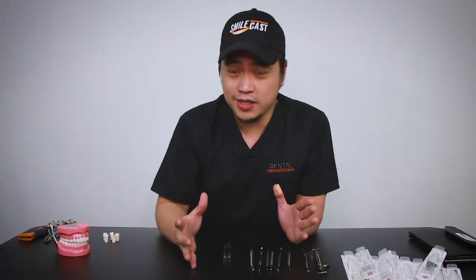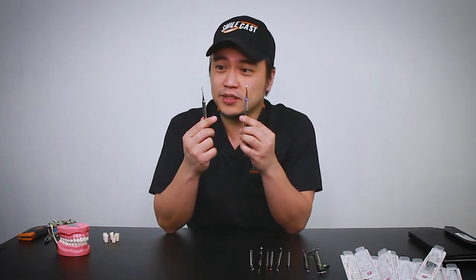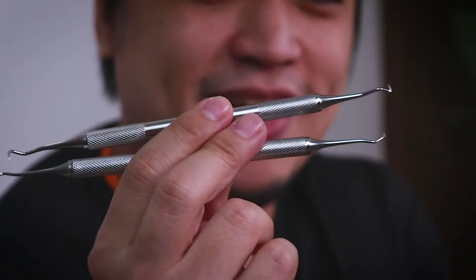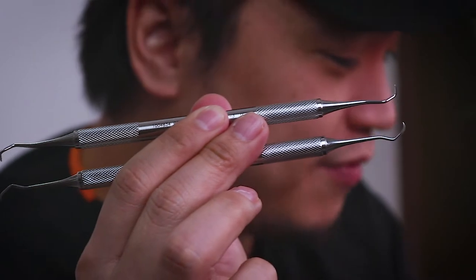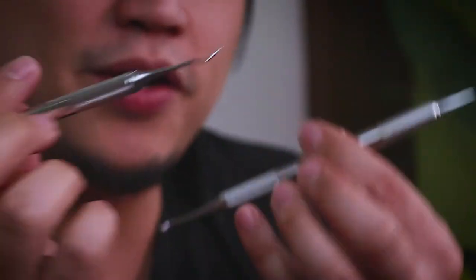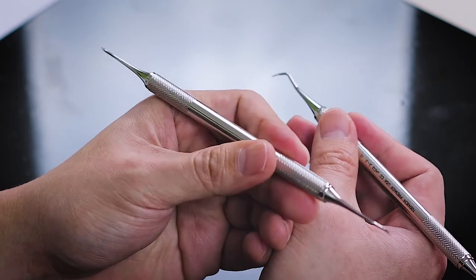Before going into ultrasonic scalers, we also have the manual scalers. Do this by hand, folks — using your strength, dexterity, and skills to remove like they used to do it back in the day. These are pretty common and have thicker handles compared to everything else, because you need to control the force a lot better. With thicker handles, it's a little bit less tiring when you're working in such small areas and your grip is a lot better.